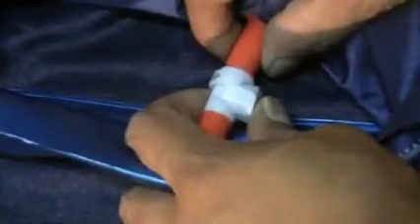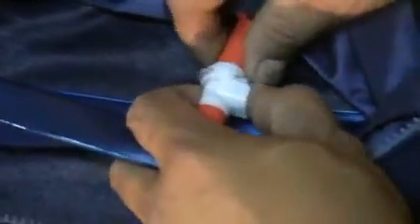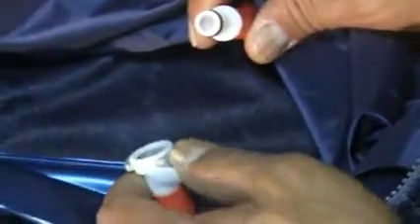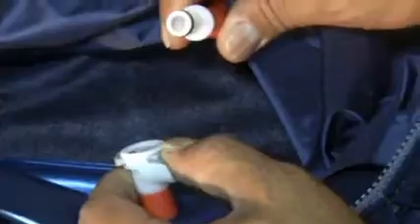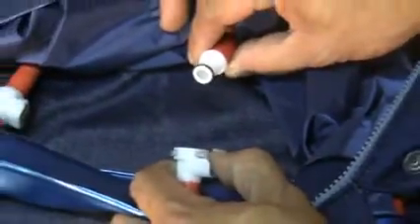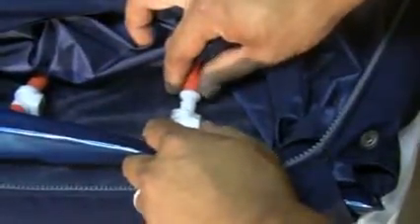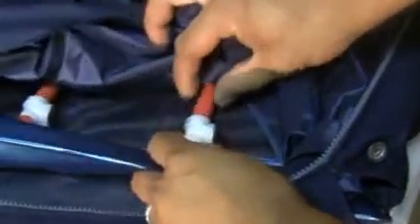They are connected with male and female connectors, which you are able to separate by using the push lock, engaging that and releasing the female from the male side. You want to ensure that all male-female connections from your cell to air manifold are firmly connected.